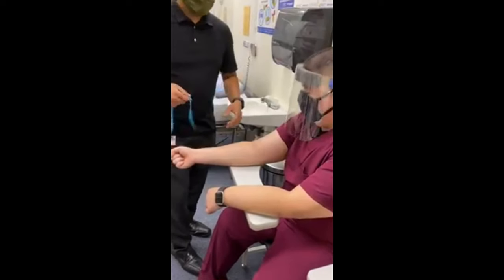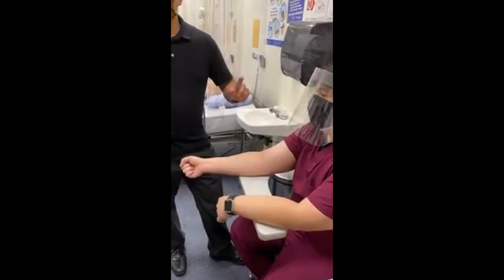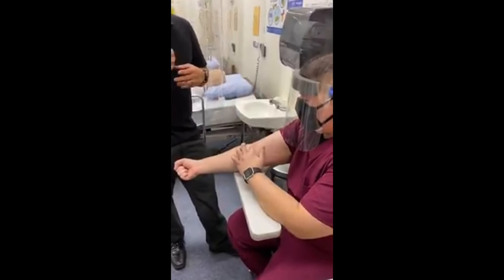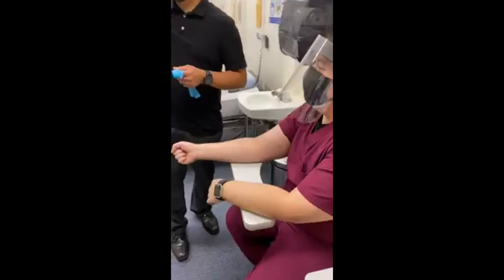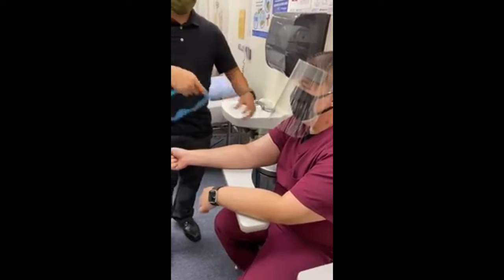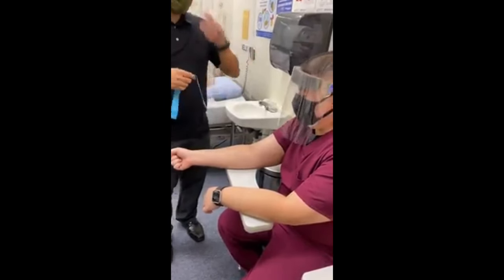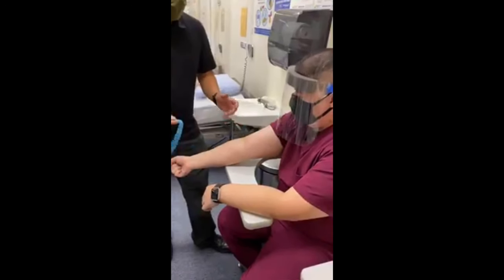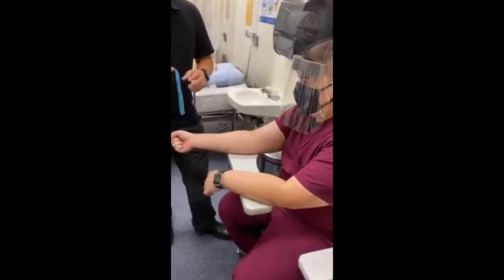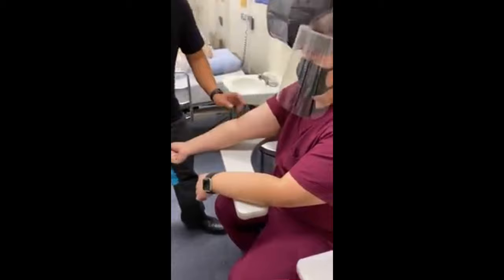When you're feeling for the vein, I highly recommend feeling it without your gloves first on a patient. This will get you used to it. For me, I skip the first part. I wear my gloves right away, put this on, feel it, I can feel it already, then I stick. But since you guys are starting, just to get you familiarized with where the vein is at, add this step in the beginning: put on the tourniquet without gloves, feel for it.